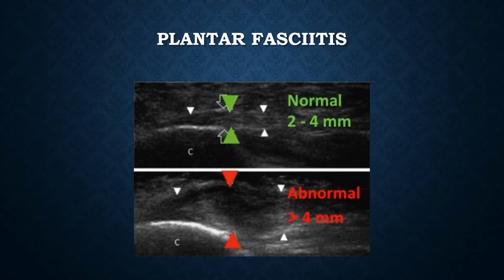Some patients have symptoms of plantar fasciitis with thinner ultrasound measurements less than 4 millimeters, and this could be due to tissue sensitivity or some other mechanisms. On the opposite end of the spectrum, we've also seen some patients who don't have any symptoms at all, but have plantar fascia measurements greater than 4 millimeters.